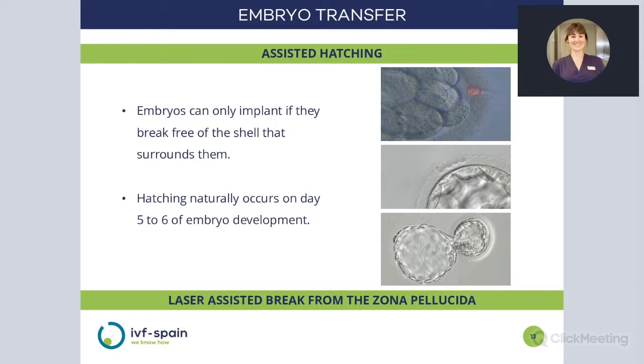In the laboratory, we can assist this process because we can make little breaks in this shell so that it will be easier for the embryo to come out. And when is this indicated? We find little benefit in performing assisted hatching in fresh embryo transfers. Fresh embryos should be able to hatch naturally. Nowadays, studies don't really point to a benefit of doing this.